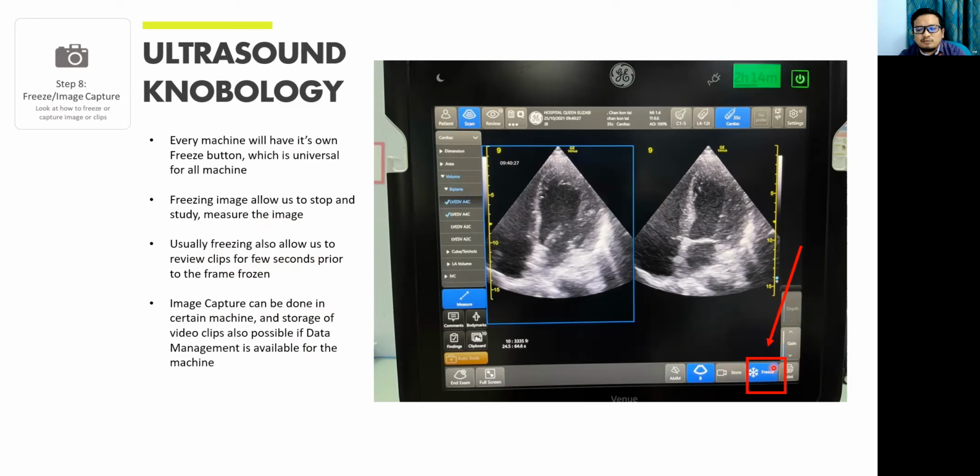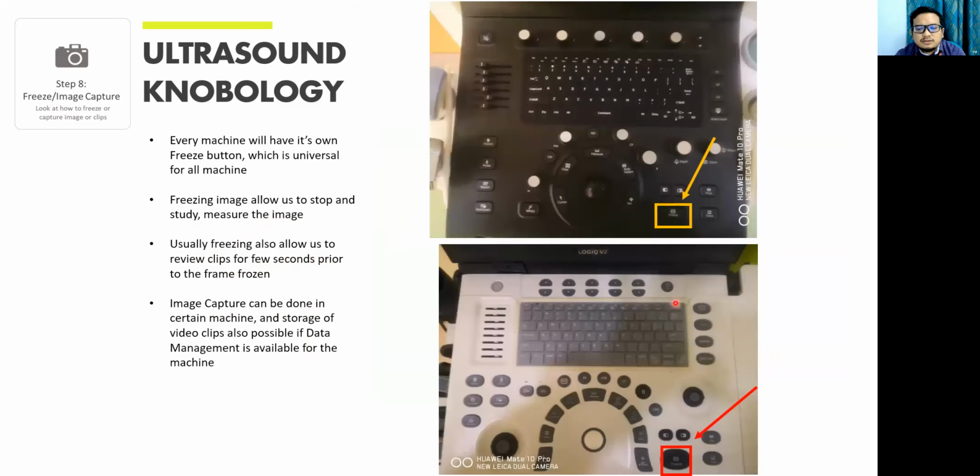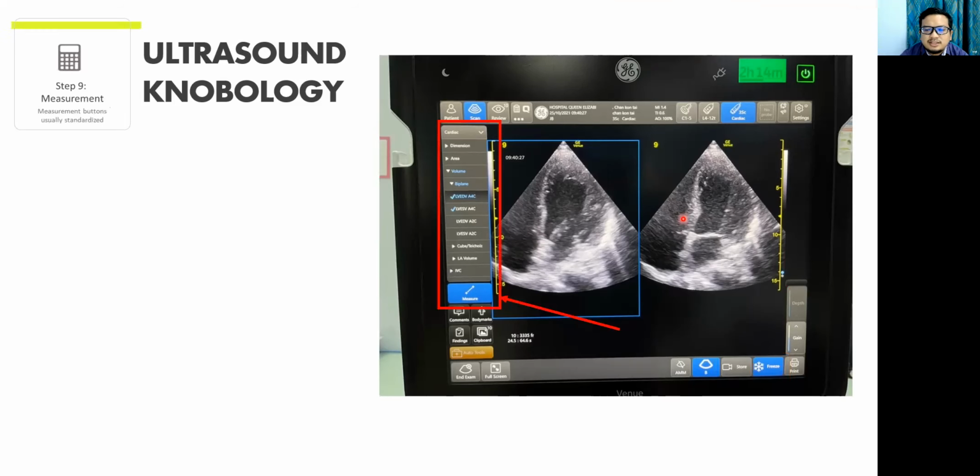When you press store, if you freeze and then you store, you store the image. If you don't freeze, you can store the video clips of the image. So like the freeze in this ultrasound example here.